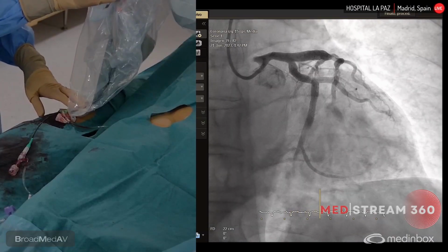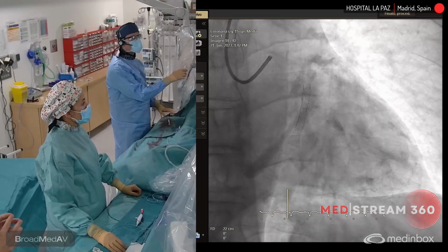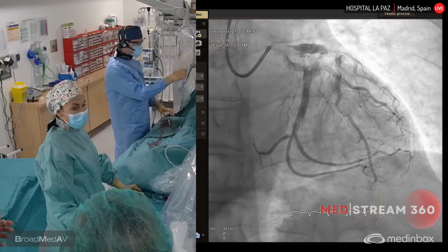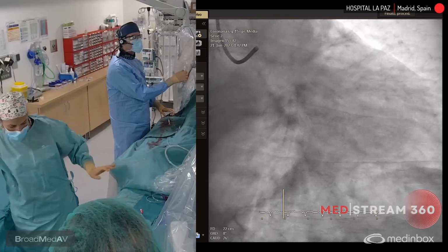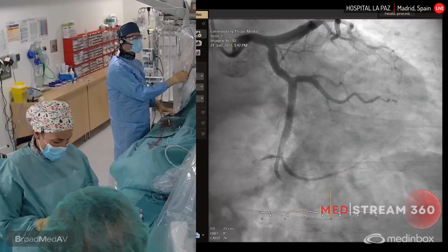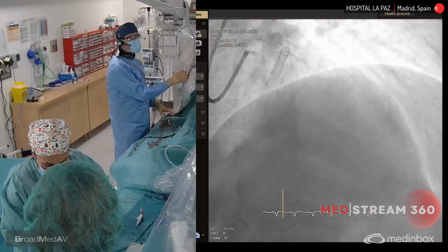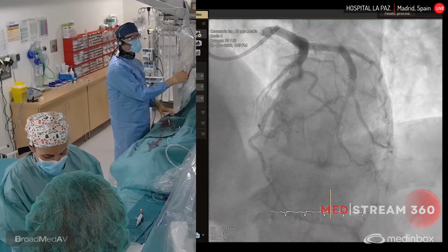I'm going to show you right now. You can see the stent flow is much better than the other day, but you can see some haziness at the distal part of the stent. I show you another projection here in the distal side. That is an enormous vessel. And this is the lesion at the mid part of the LAD that we are considering to include in the vulnerable trial.